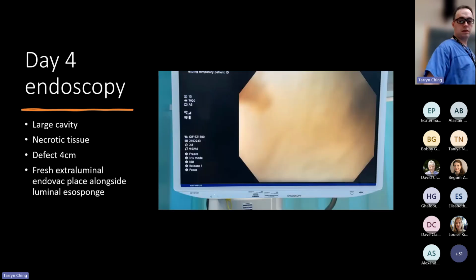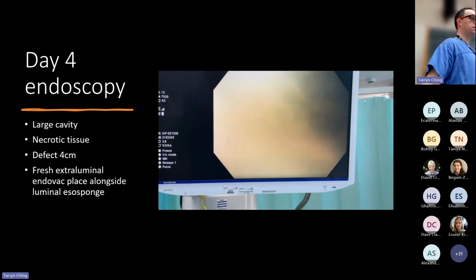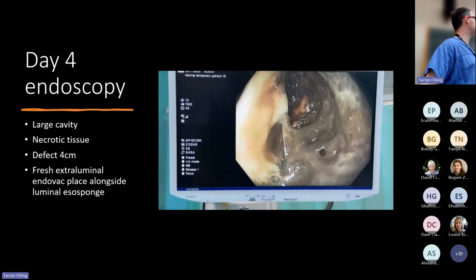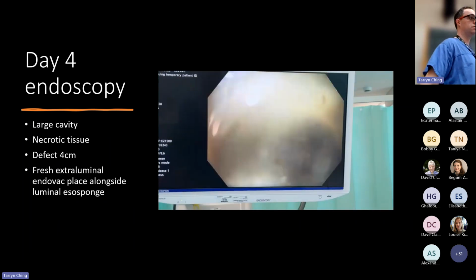This is an endoscopy on intensive care here at the JR. What you're seeing is me trying to poke the tip of the endoscope out into the mediastinum and pleura. What you can see there on the right is the back of the heart, posterior pericardium, and that's looking upwards into the mediastinum and left chest. We can see extensive mediastinal contamination. If I played that for another 5 minutes or half an hour, you'd see us doing an extensive lavage, retrieval of foreign bodies, and clean out.